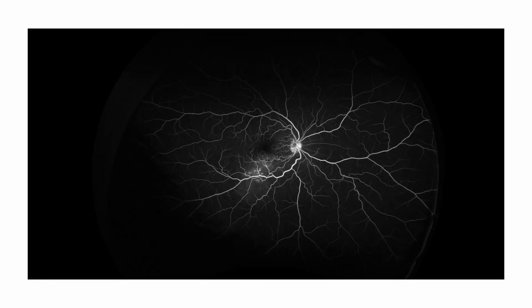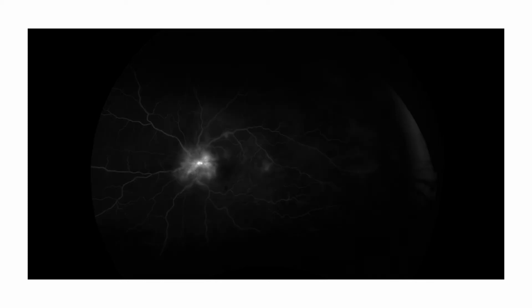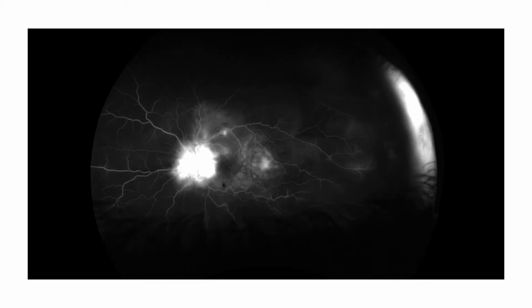An angiogram of the right eye. Here is an earlier frame. You can see some blockage by the chorioretinal lesions. This later leaks and pools in the area of serous detachment. The nerve is also hyperfluorescent, denoting inflammation. Same in the left eye. In a later frame, we can see some vascular leakage, denoting some level of concurrent vasculitis.